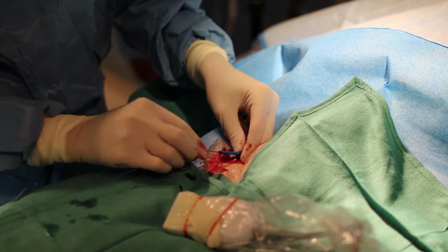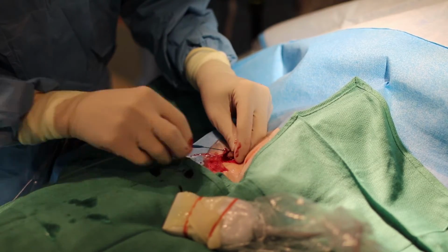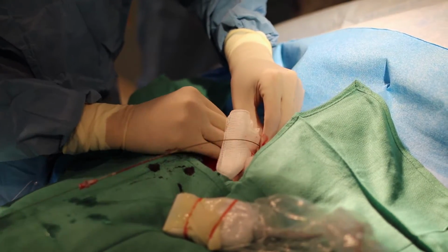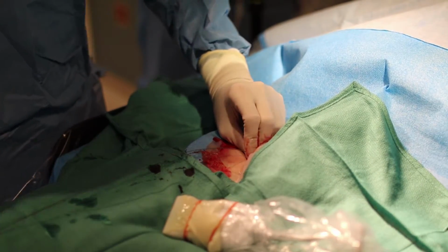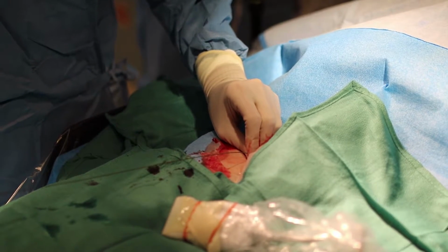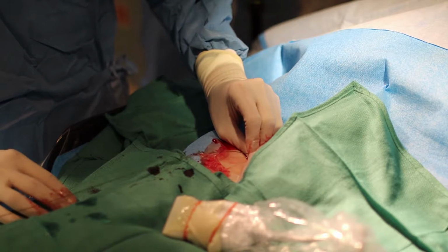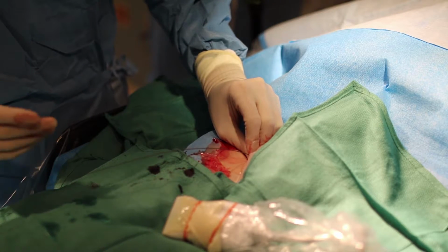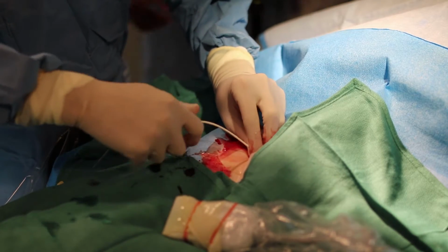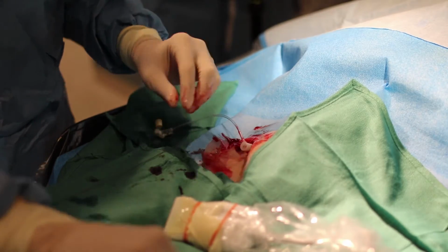So now I have the artery. I'm just going to show you the same process through the vein. We're actually using this for all of our diagnostic and interventional procedures, including the TAVRs. If you have the 5 French sheath, we'll just put that over. This happens to be a patient that we're evaluating for a TAVR, so we're going to do a right and left heart cath, hence the reason for the venous access.